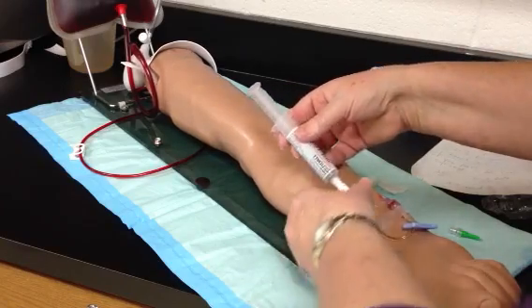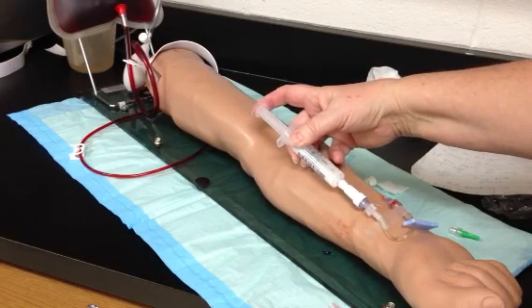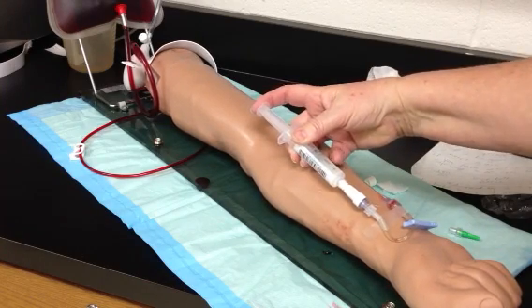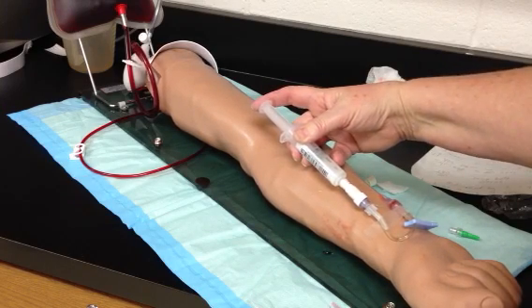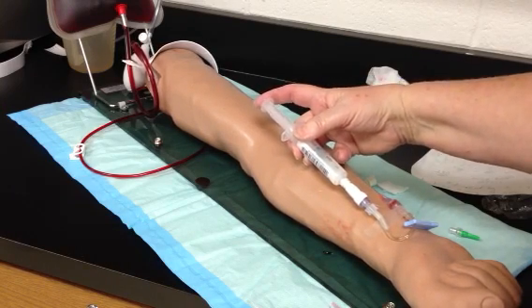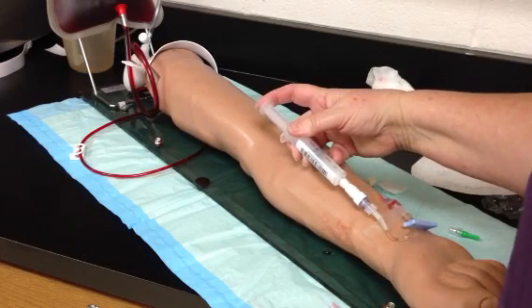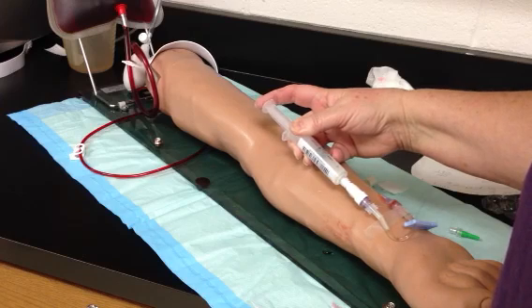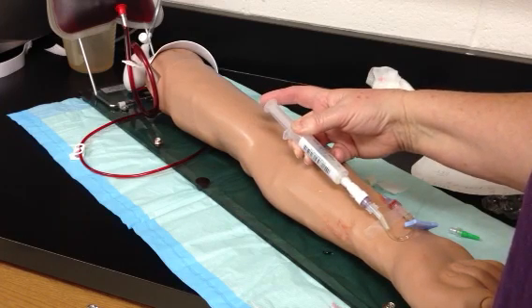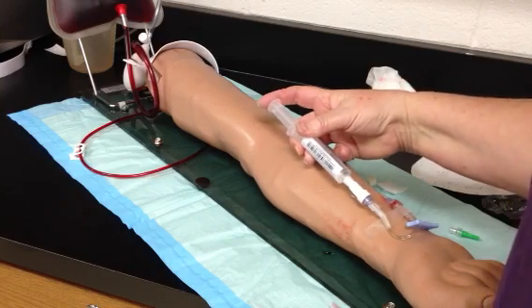And actually, I'm going to need to refigure, because my saline 10 milliliter syringe doesn't have the same amount of lines per milliliter as my 3 milliliter syringe. So I have to refigure that. I'm going to then again, once I've done my math, do a short push, wait the allotted amount of seconds, do a short push, wait the allotted amount of seconds, until I have pushed 1 milliliter of saline.